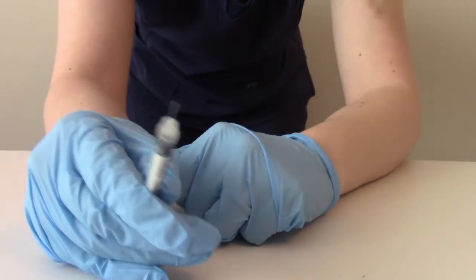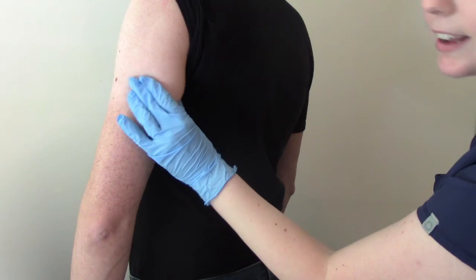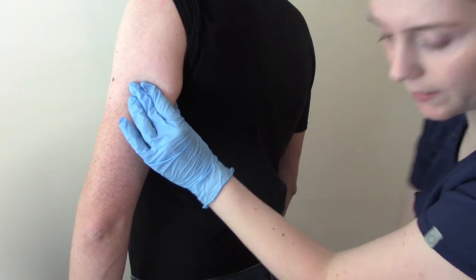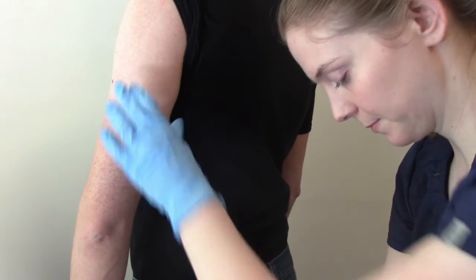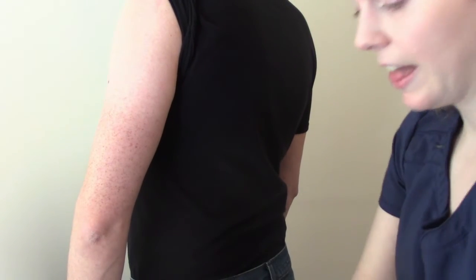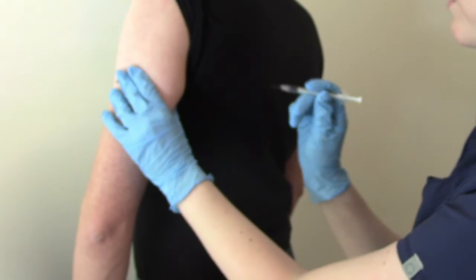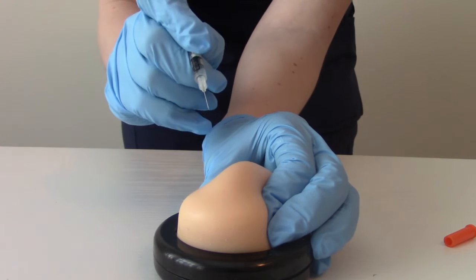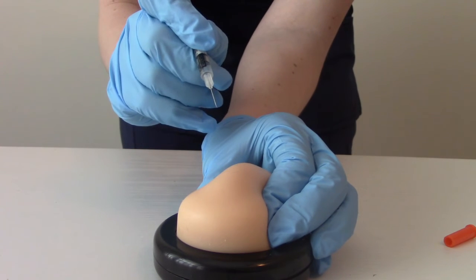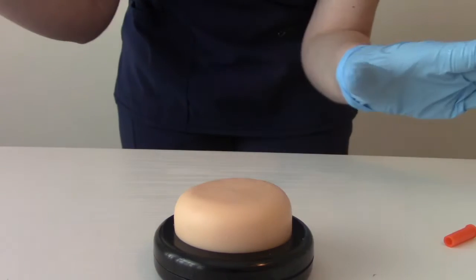Now we're ready to go give it to the patient. You want to find the fatty part at the back — we're going to pinch it when we give this injection. First we're going to wipe it off with our alcohol wipe. Then bevel up, and we're going to go at a 45 to 90 degree angle and inject. Pinch the skin, bevel up, 45 to 90 degree angle — inject, let go.